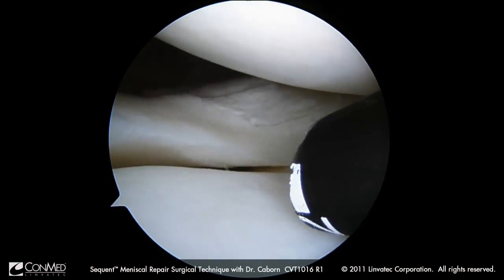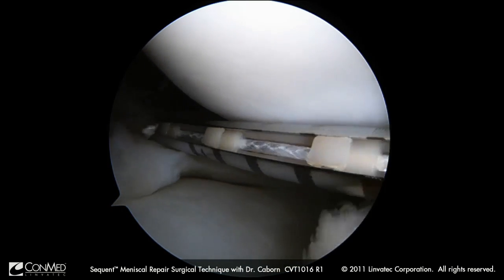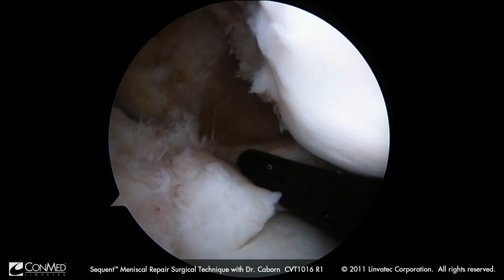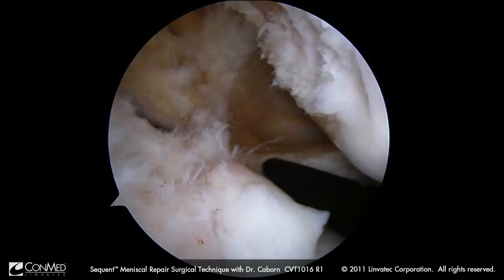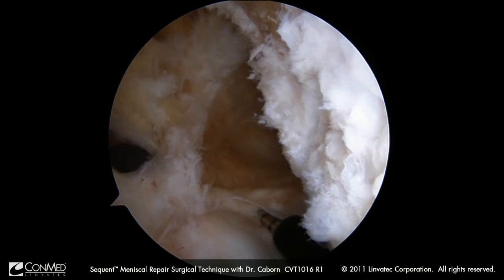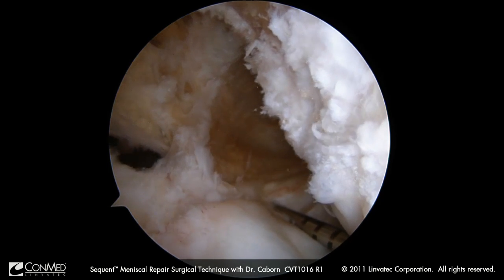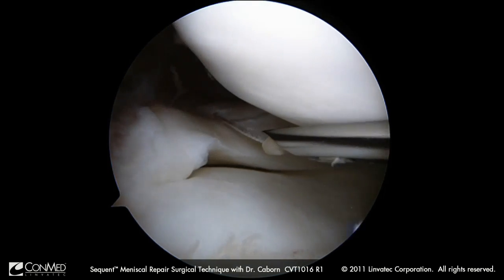Cannula into the joint, and then seat on the cannula. Now we can see our implants in position. I am going to come over the top to where I want to place that initial stitch, then I go through — here is my trigger. I am going to deploy that first implant, wiggle, come back. I like to make sure that I am facing down with the tip of my needle so that as I come back it stays in position. And so I am out now with my first one.